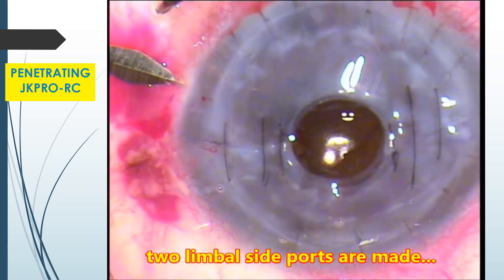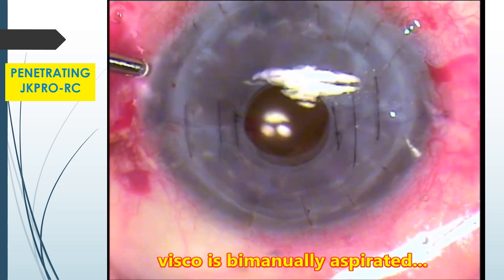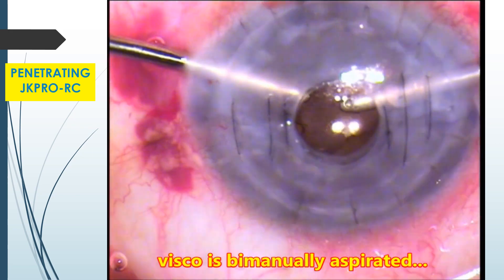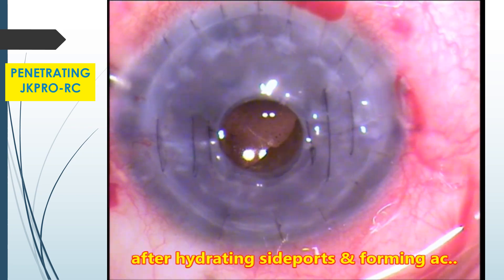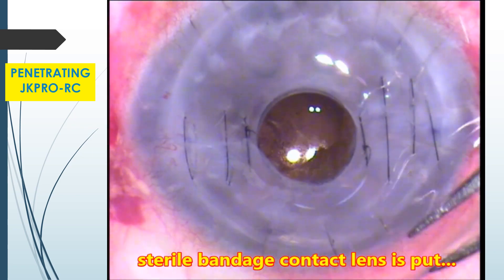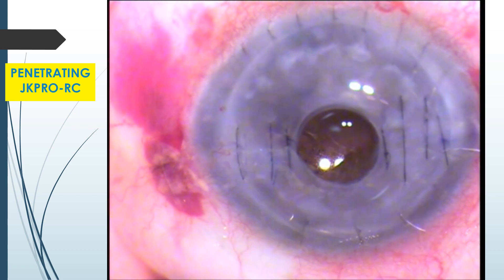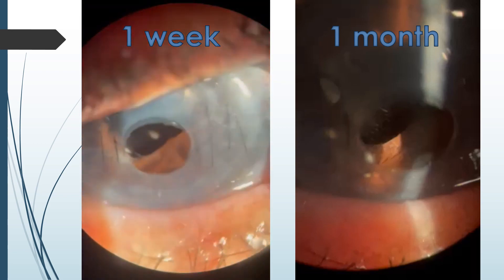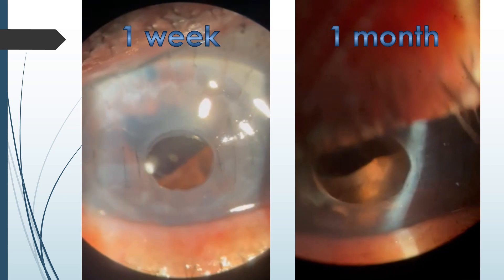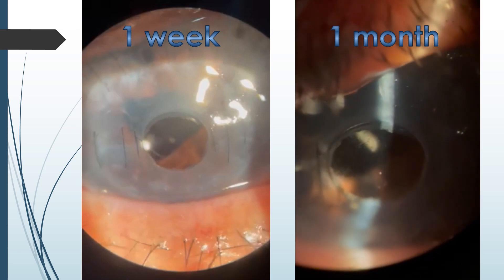Two limbal side ports are now made. After hydrating side ports and forming the anterior chamber, a sterile bandage contact lens is put. Six hours post-op, the patient's vision improved from hand movements to 6/24. She was very, very happy. These are the one week and one month post-op videos. Notice the anterior chamber depth — the chamber is clear and the iris is free from the optic. No retrolenticular membrane formation.